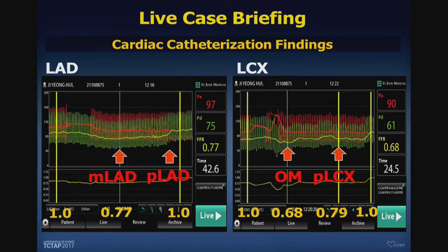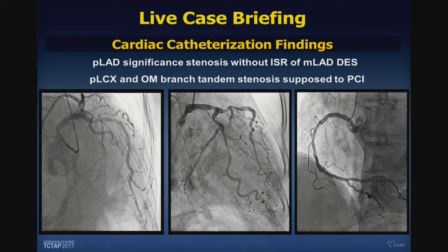Yesterday, after finishing the coronary angiogram only, I felt like only touching the distal circumflex region. But discussing with my team, the FFR should be done in this patient because the proximal LAD and proximal circumflex region might be significant, even though it seems insignificant, maybe the intermediate region. But unluckily, the patient has a very severe FFR value, under 0.8.